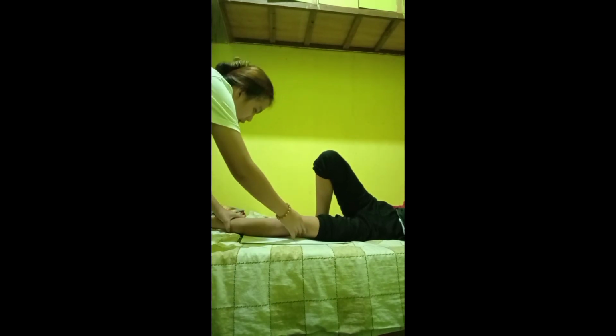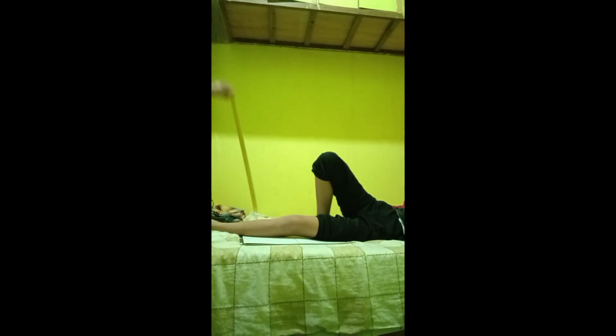The central ray of this projection is directed 5 to 7 degrees cephalad, entering 1 inch distal to the patient's medial condyle.